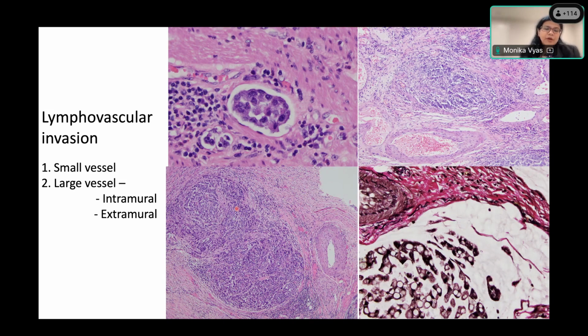But then if you have a tumor nodule next to this thick walled artery, then that means that it can potentially be a vein which has been completely destroyed by the tumor. So that is large venous invasion. So if you see a remnant vessel wall, then you're done. You can report it on H&E.